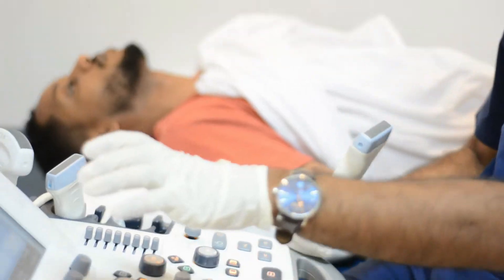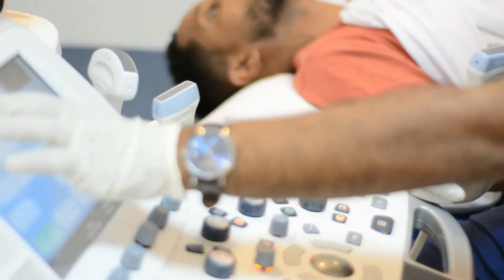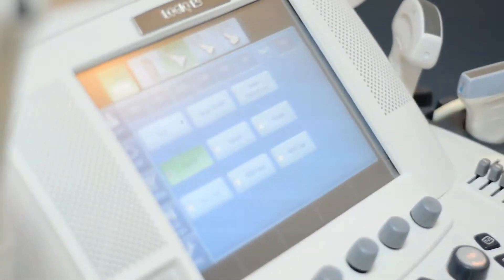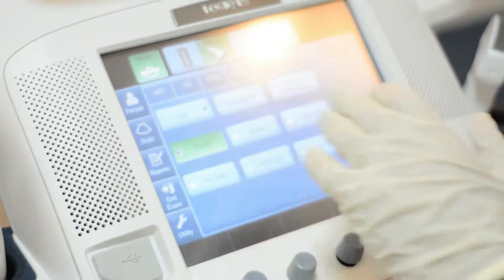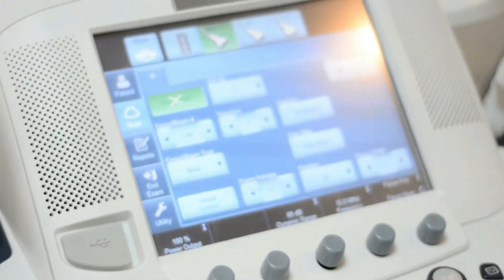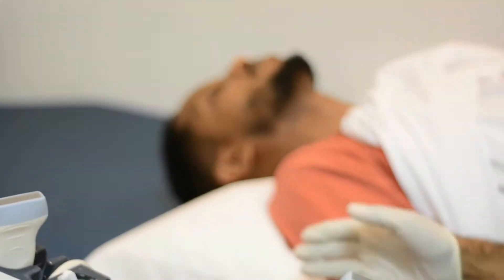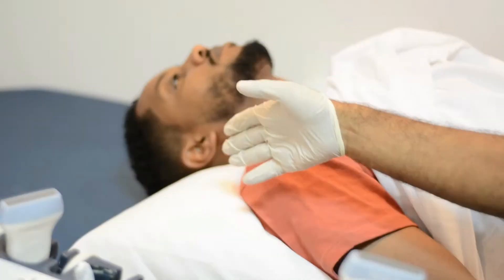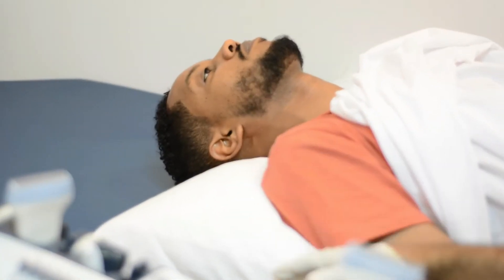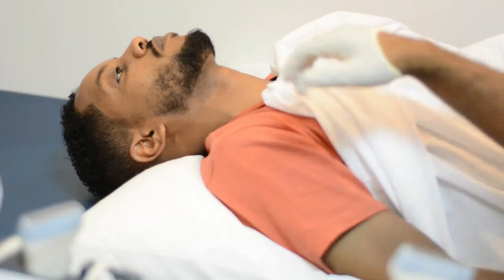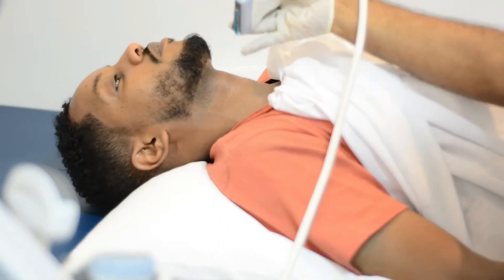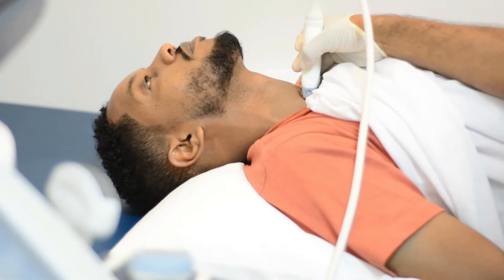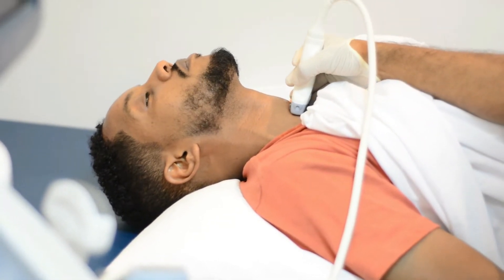I'm going now to select the 15 megahertz probe and adjust the machine presets — they show thyroid. Here we have our patient lying supine, and we put a pillow under his shoulder in order to extend his neck. I will bring the probe and place it above the sternal notch.